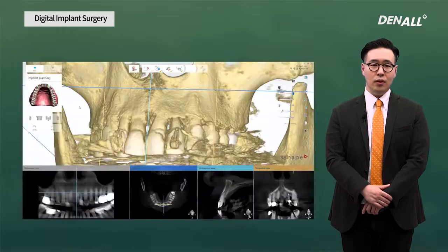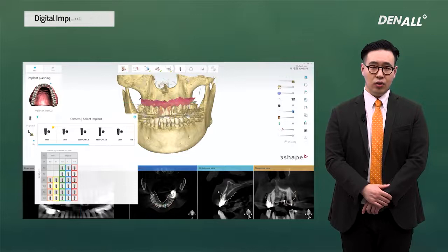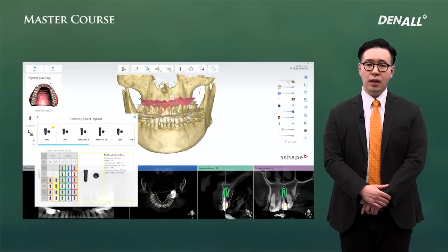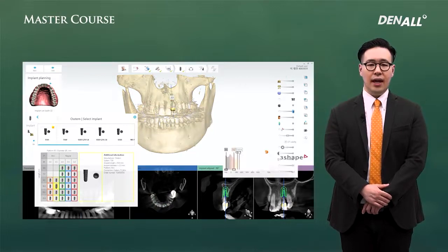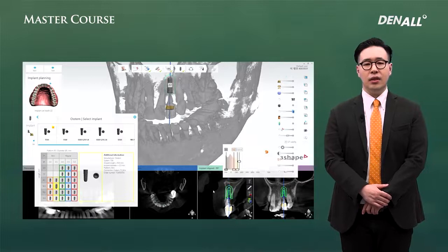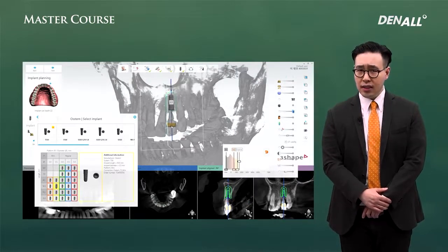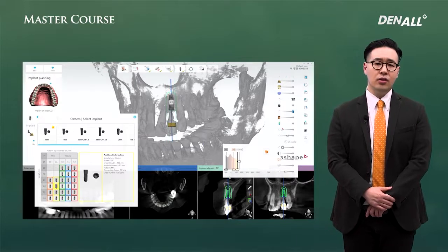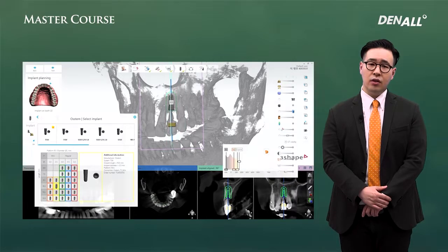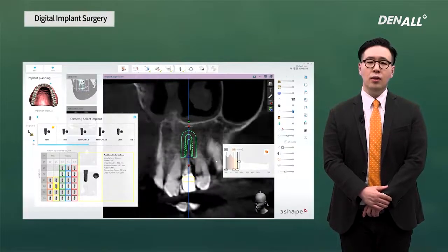After the merging, in the merged status, CBCT data will be used. A pre-planned implant with a specification will be included in the CBCT. First, at the bottom, the CBCT implant is positioned. After that, more detailed three-dimensional angulation can be done in the upper image, the three-dimensional reconstruction image, and more detailed adjustment can be made.